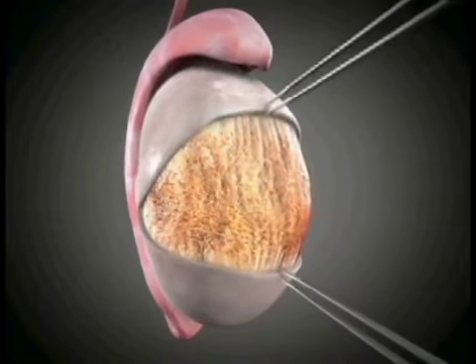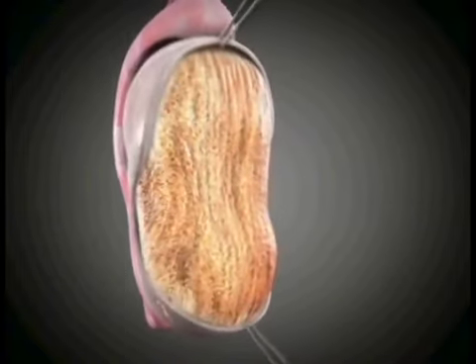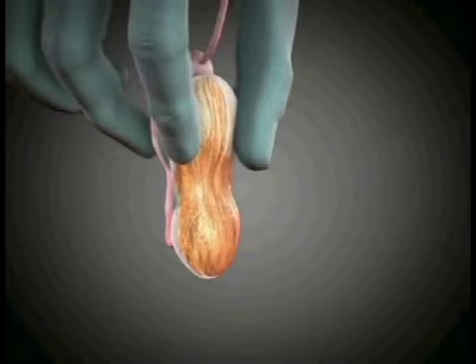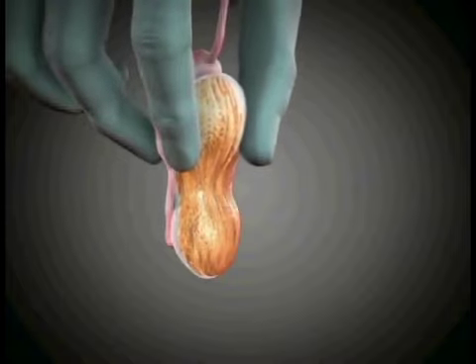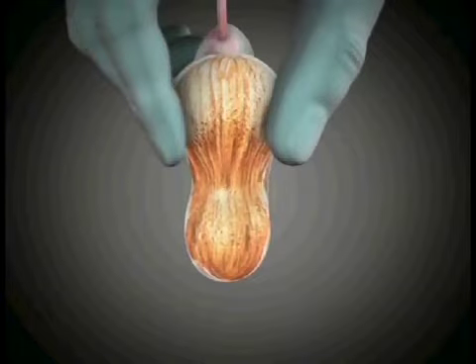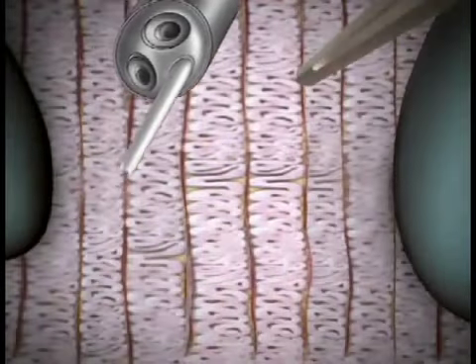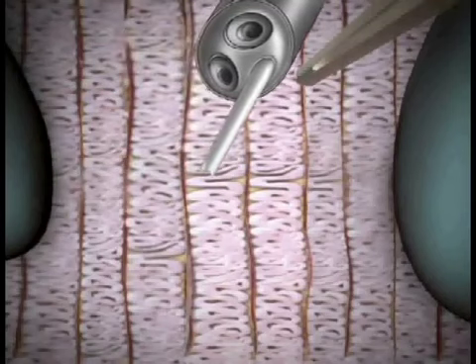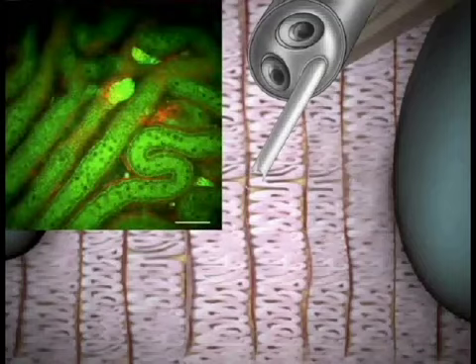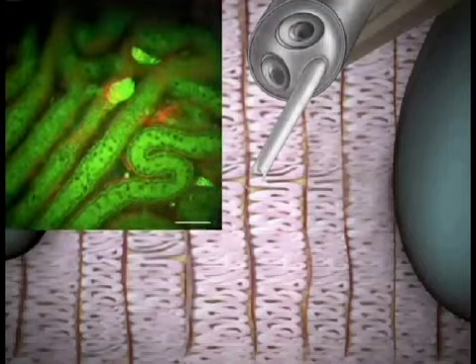The testis is incised in an equatorial plane to expose tubules. The multiphoton probe can be brought into the operating field to scan the tubules looking for spermatogenesis. When spermatogenesis is detected, then the tubules can be extracted for processing.